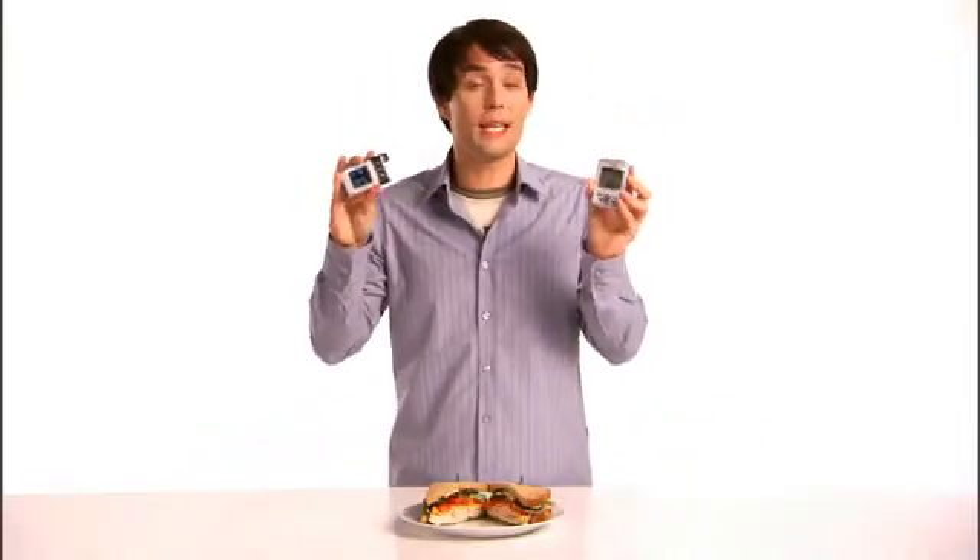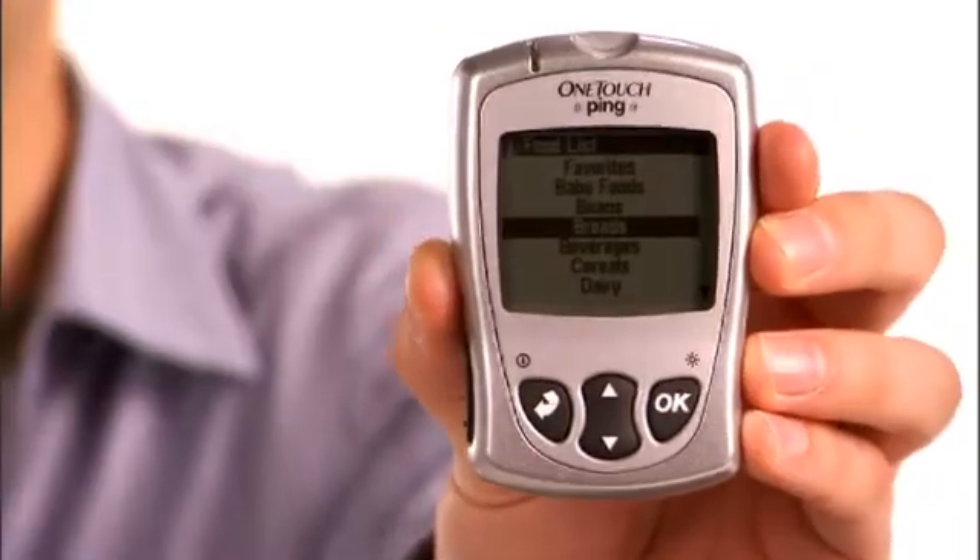So exactly how much bolus insulin do you need? Ask your pump or meter remote to help you — you can use either one to calculate your bolus amount. Even better, your meter remote comes preloaded with the carb values of 500 foods from the Calorie King food database for accurate dosing on the go.